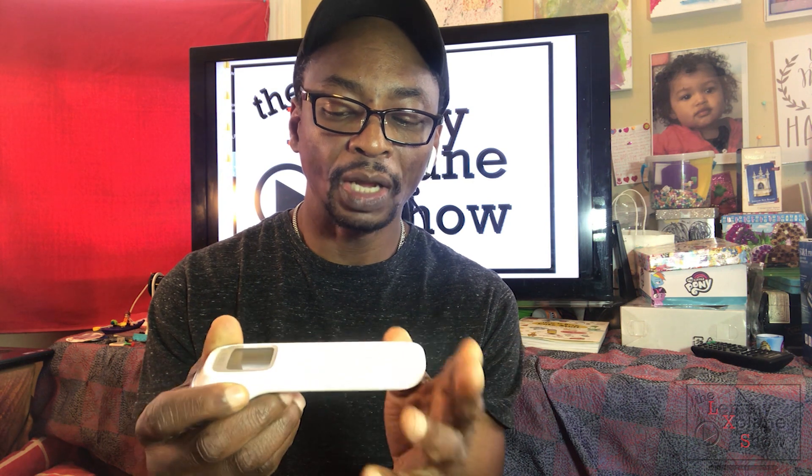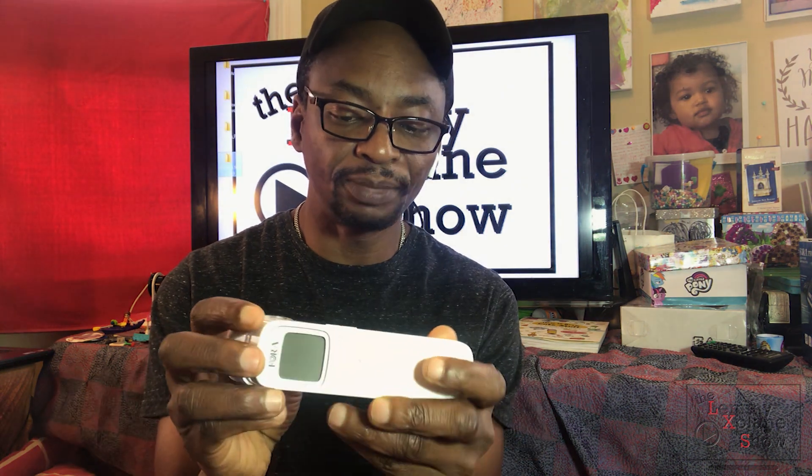Would I recommend it? I definitely would, given the price point, the ease of use, and the quality of the product. It feels really sturdy and firm — not cheaply made — and it's got a nice aesthetic. It gets a plus from the Let Me Explain show; we do endorse this product.